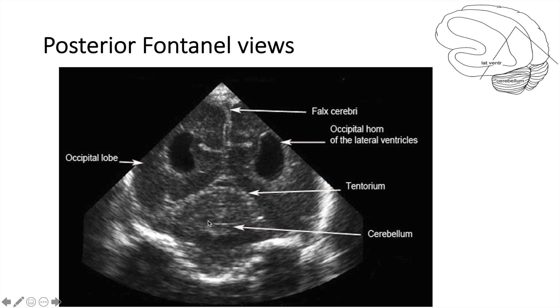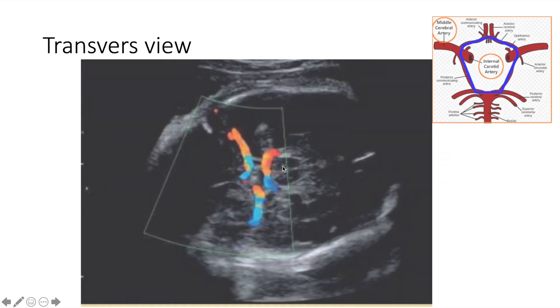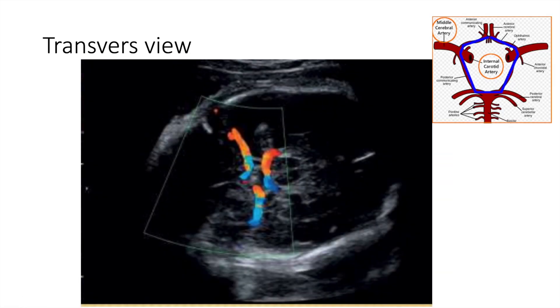You can also look at the brain from the posterior fontanelle, which gives a very good view of the cerebellum and allows you to look at cerebellar hemorrhages. This is a transverse view of a baby with post-hemorrhagic hydrocephalus — you can see the dilated lateral ventricles on each side as well as a dilated third ventricle. With good probe technique, you can also see the whole circle of Willis.